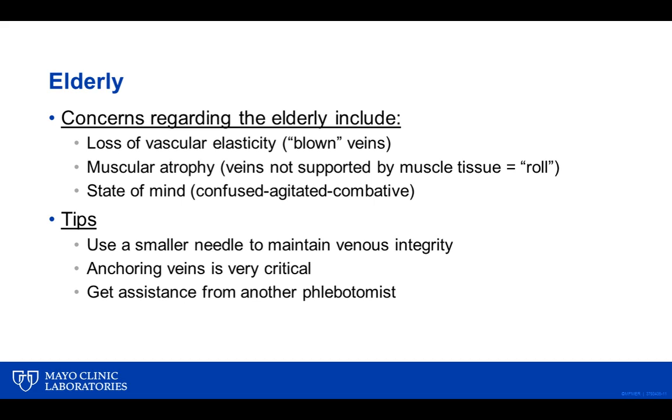Some of the tips: you might need to use a smaller needle for those tiny little surface veins or the veins you're going after, the thin-walled veins. You don't want to damage them. Anchoring the veins is critical. You want to grab with your offhand and pull down on that skin to hold that vein in place and make sure you're coming in right on top of the vein.